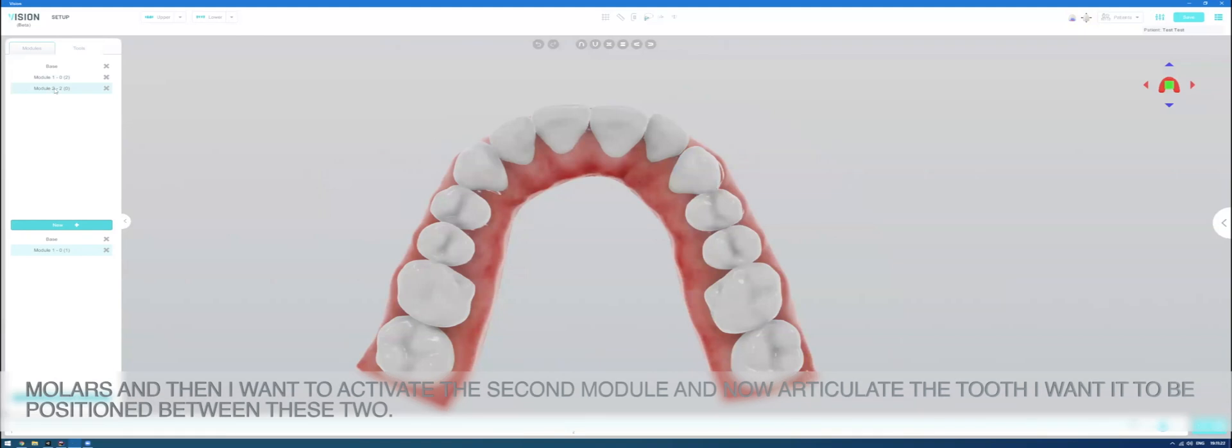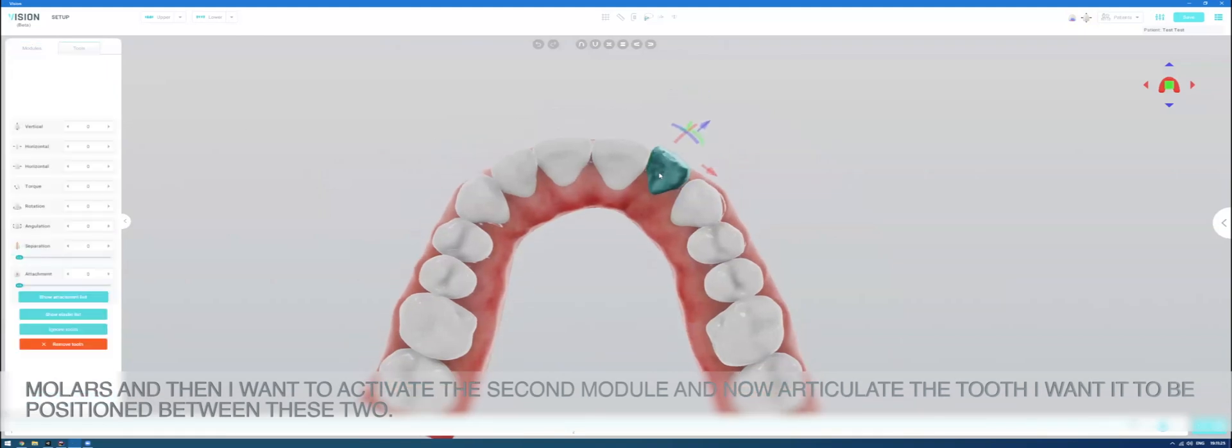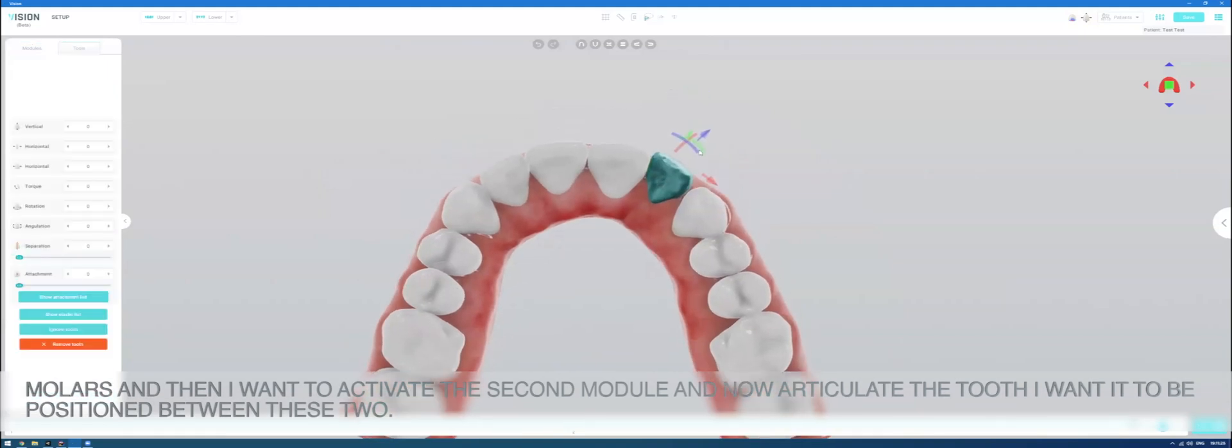And this tells me that there is one module for the motions of the other molars and then I want to select, activate the second module and now articulate the tooth I want it to be positioned between these two.